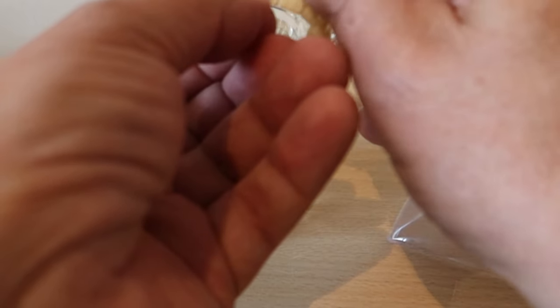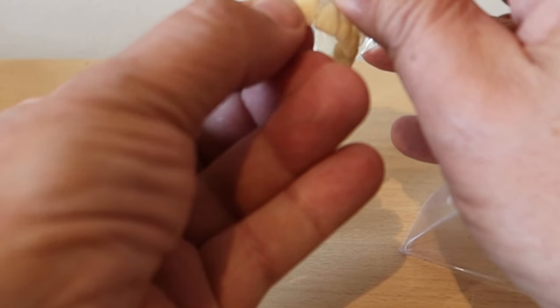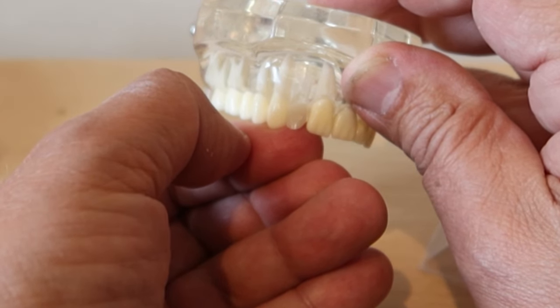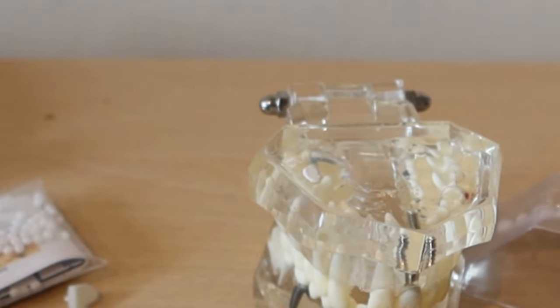We'll just cut these with a normal pair of scissors so that we've just got the tooth we need. It's a bit fiddly but you can see that that one now fits the gap on my friend. Obviously this isn't going to hold in position on its own so we need to put that to one side for the moment.